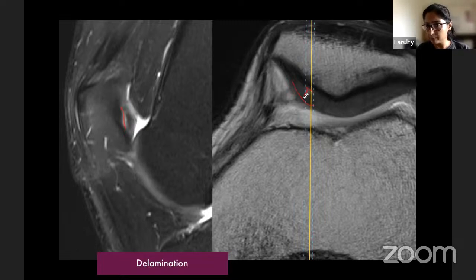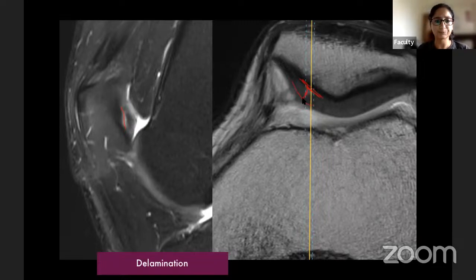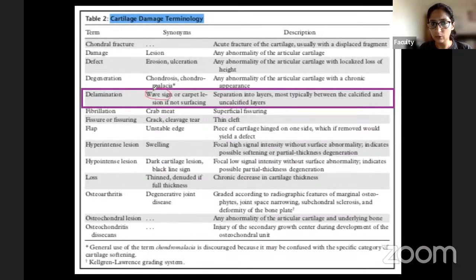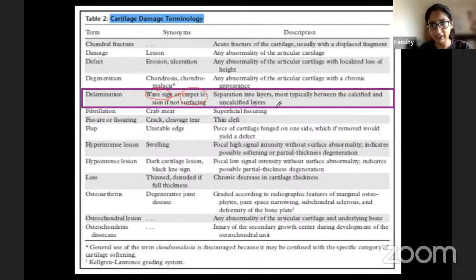Delamination may communicate upward via a fissure, or you may have radial zone delamination without a communicating fissure, depending on the mechanism of injury. Delamination is also referred to as a wave sign or carpet lesion. It represents separation between the calcified and uncalcified layers, occurring at the radial zone junction.